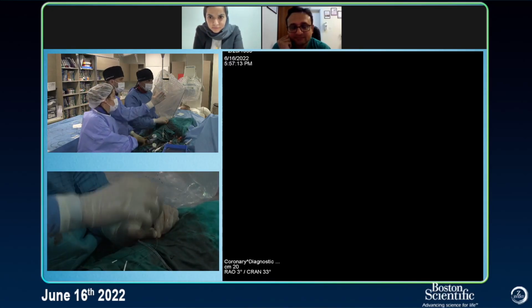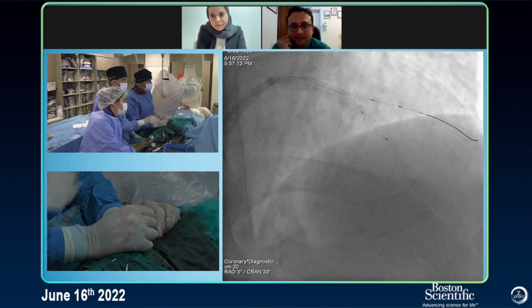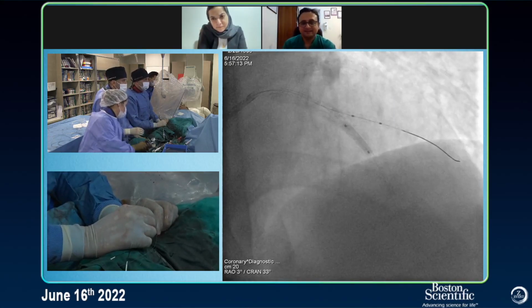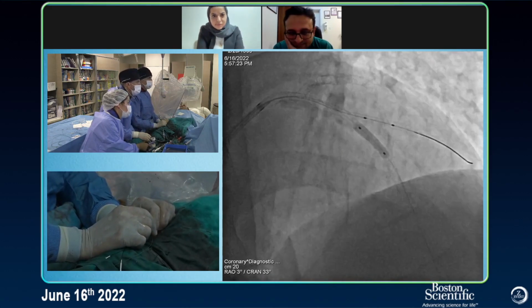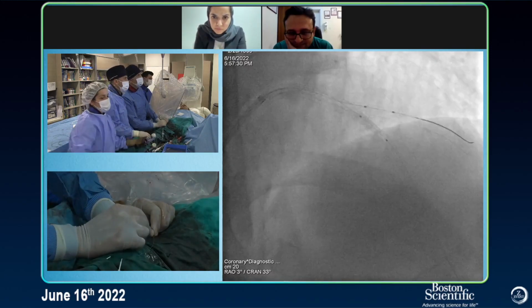Down. Good here, but the box easily expands. I don't like it that much. Go up here. 10, 12, 10, because we have two balloons. 10, 12, 12. 14, it's okay. Now it's okay. Down. Let's do kissing and let's see the result.